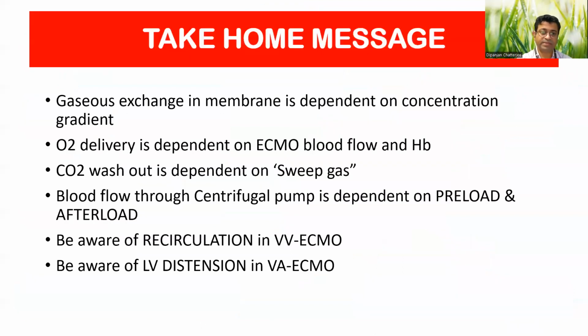Finally, the take-home message: the gaseous exchange in the membrane is dependent on the concentration gradient of gases across the membrane. The oxygen delivery is dependent on the blood flow and the hemoglobin concentration. CO2 washout is dependent on the sweep gas, and the blood flow through the centrifugal pump is dependent on the preload and afterload. You need to be aware of recirculation in VV ECMO and be aware of LV distension in VA ECMO.